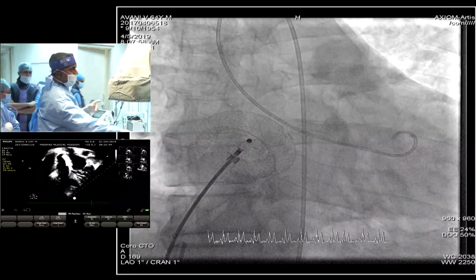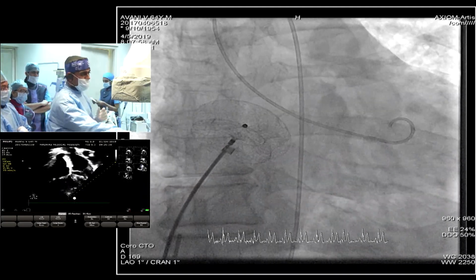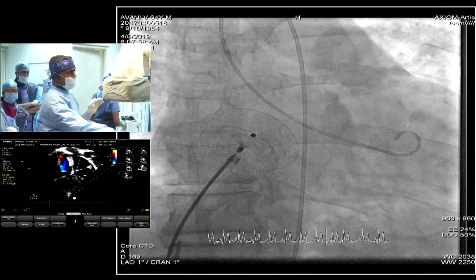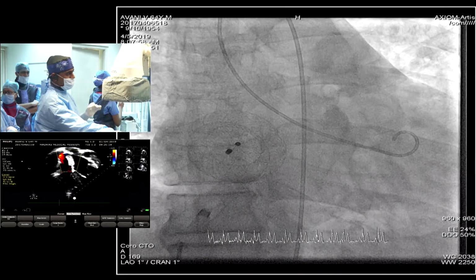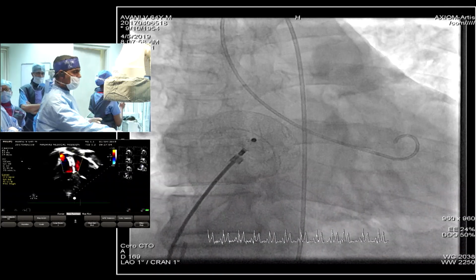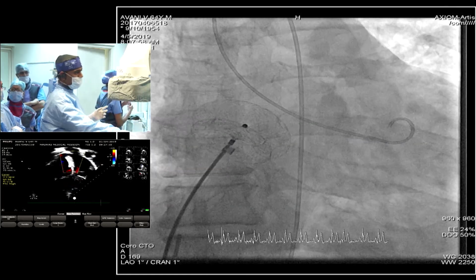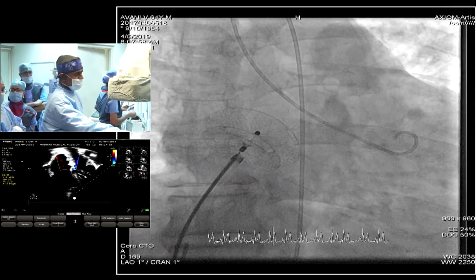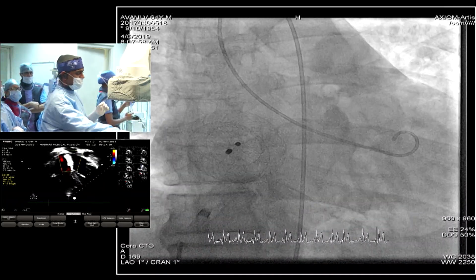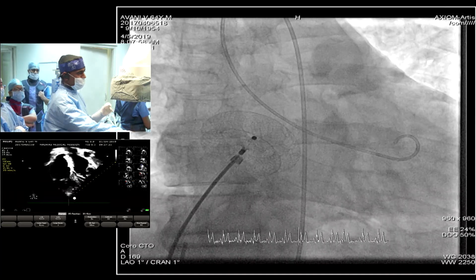Okay, actually, I would say that our device embolizations are rather predictable. I'll tell you how we get into that. There will be a patient who has a deficient IVC margin, and we will advise the patient that surgery is the best option. There will be a few patients who will insist, for a variety of reasons, either cosmetic or fear of surgery. Fully understanding the complexity of this procedure, they will still say, why don't you give a try, and if the device is slipping out, then I will accept that I have to go to the surgeon's table. Otherwise, give me a chance and let me work on it.